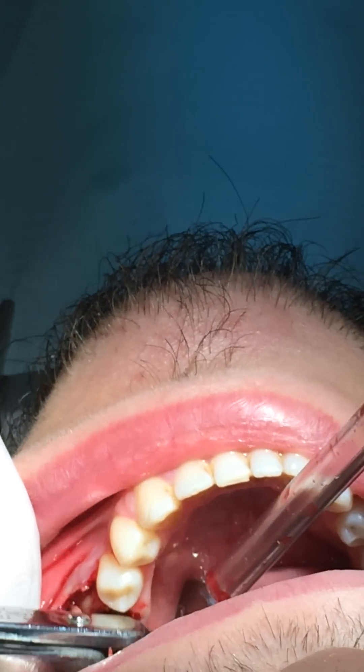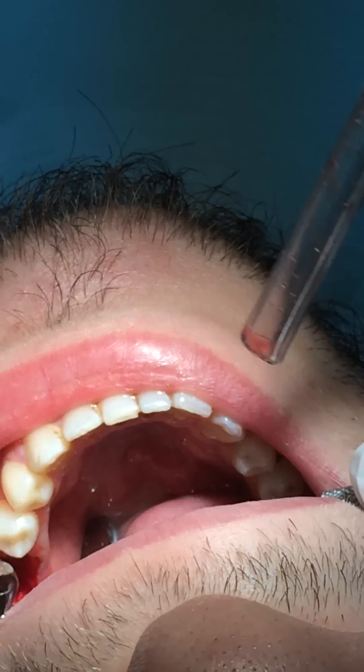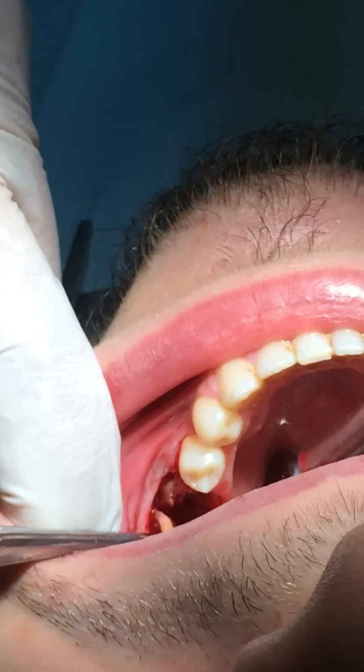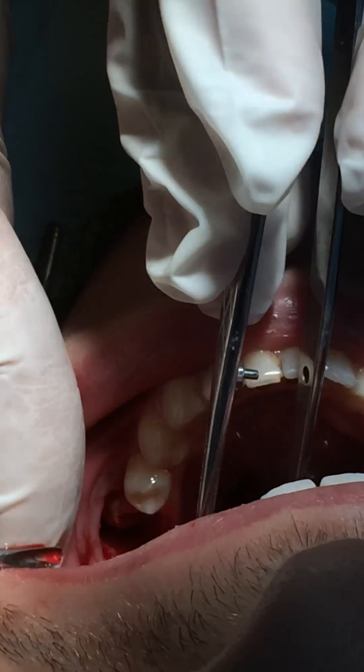Just if there is some resistance, we try to do a rotation. The problem with the root forceps... Yeah. It's coming. It's coming.